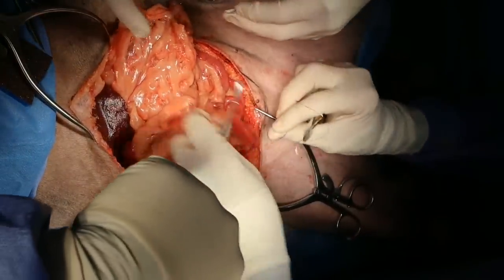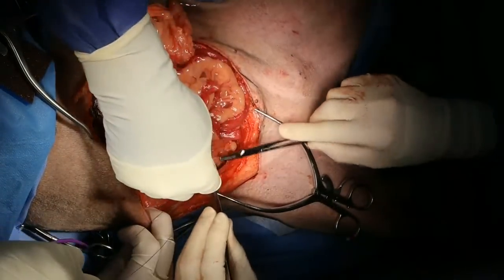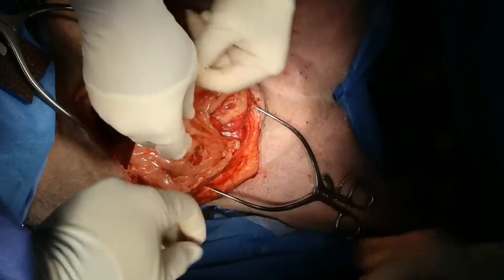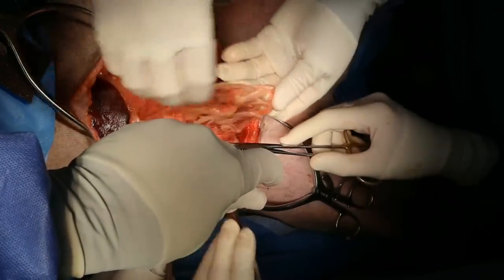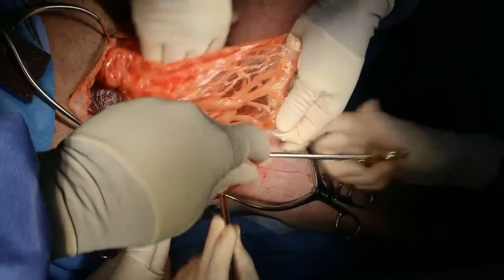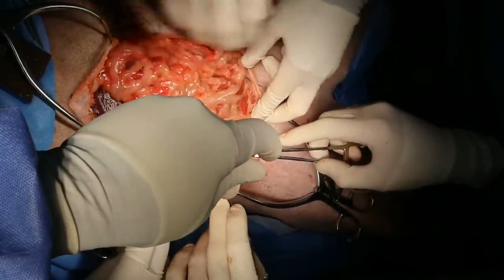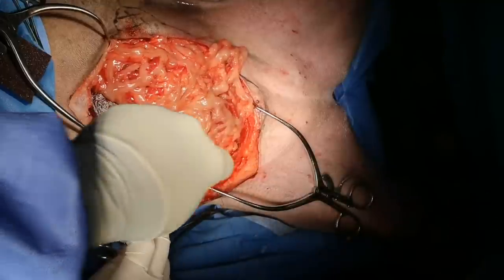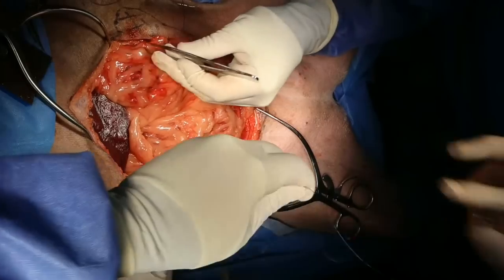Try not to strangulate the intestine with our suture. Something that might be handy is to get a moistened lap sponge and make a little dam for the intestines. So Yuri, if you see what I'm doing here, I'm just suturing it to the internal line, just to the peritoneum.